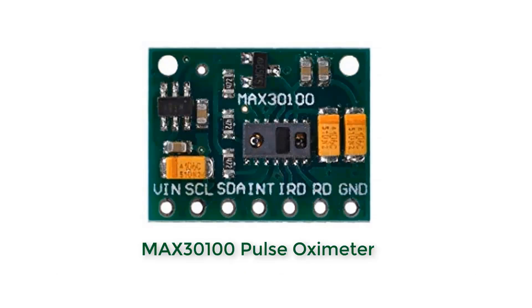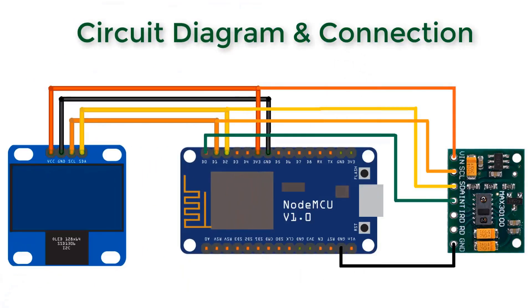We will again use the same pulse oximeter sensor, the MAX30100. If you want to learn more about this sensor, please watch the previous video. Here is the circuit diagram and connections — both the OLED display and MAX30100 have I2C pins, so the SCL and SDA pins are connected to D2 and D1 of the NodeMCU.